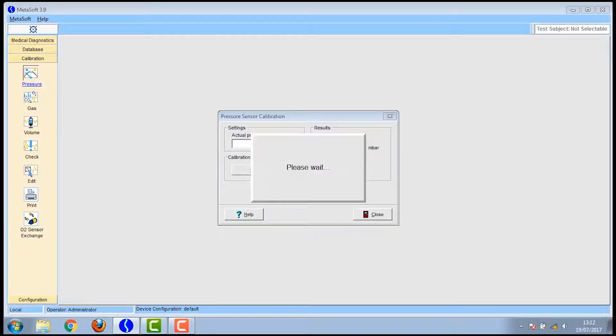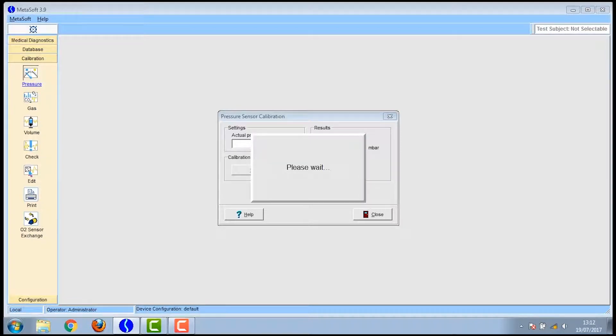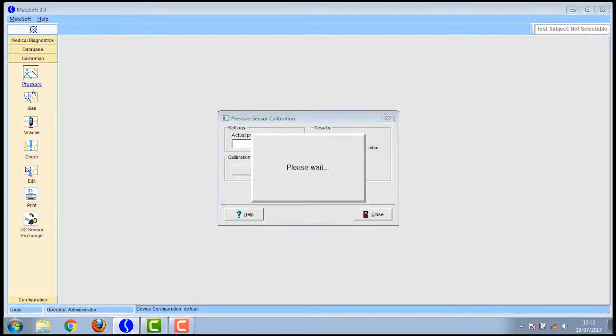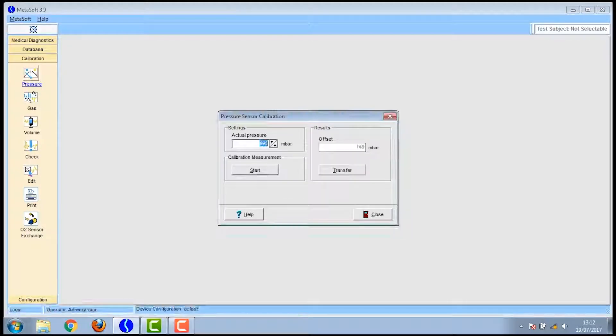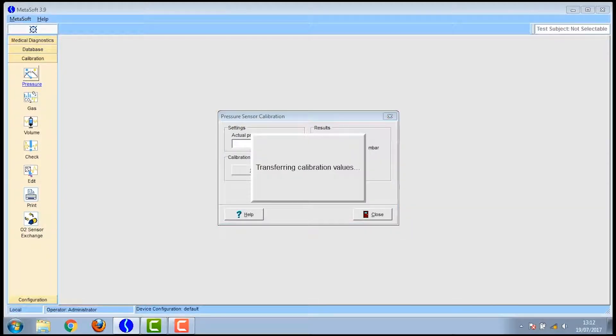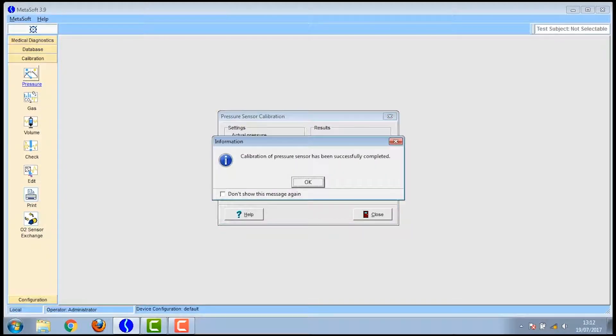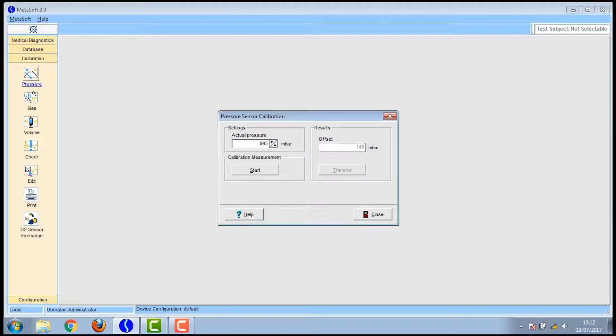You first click on the pressure icon. You then need to read the pressure on the weather station in the lab and input the value in the actual pressure box and then press start. Once this has happened you then press transfer and then it closes.